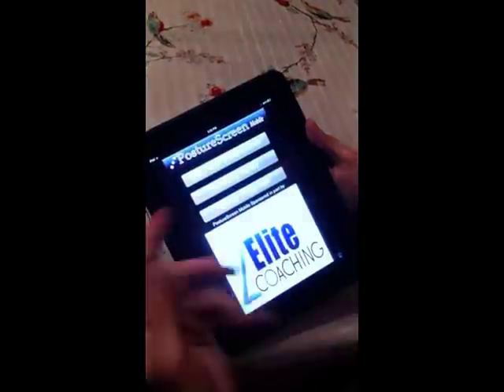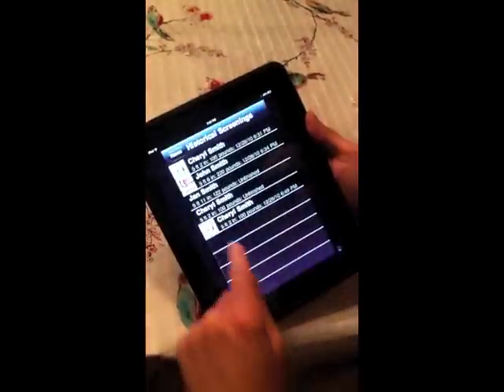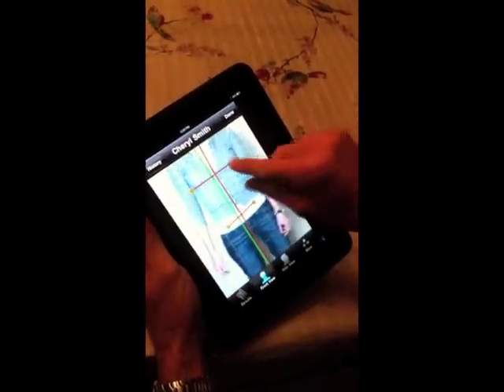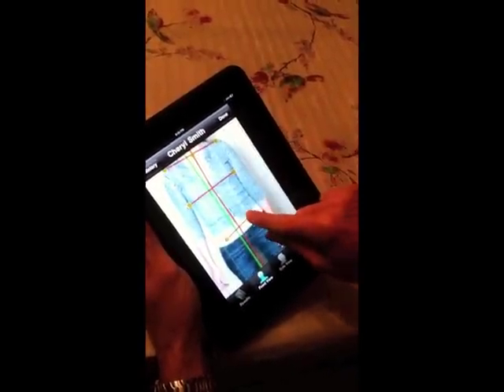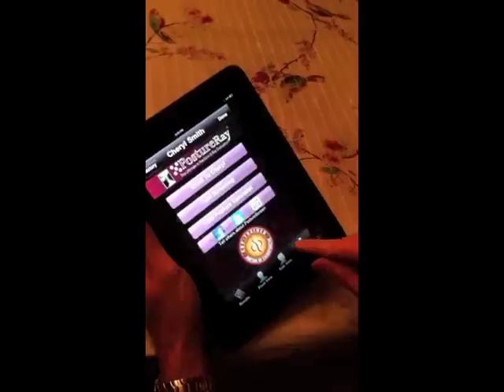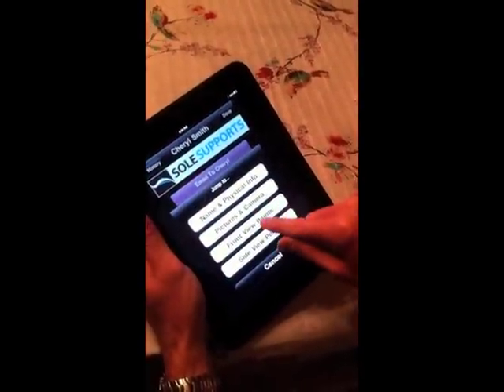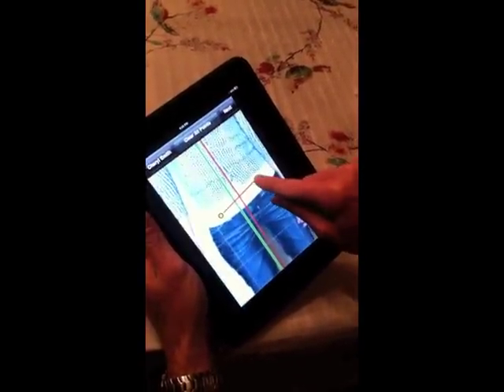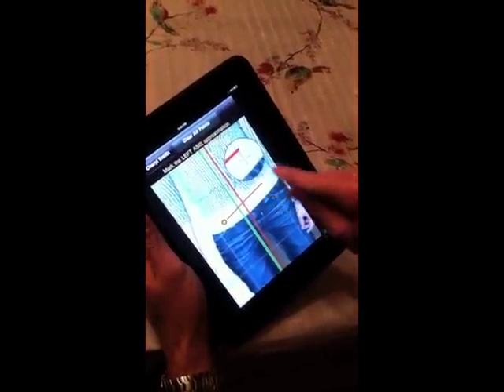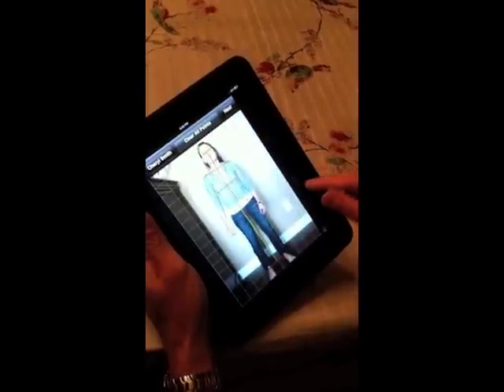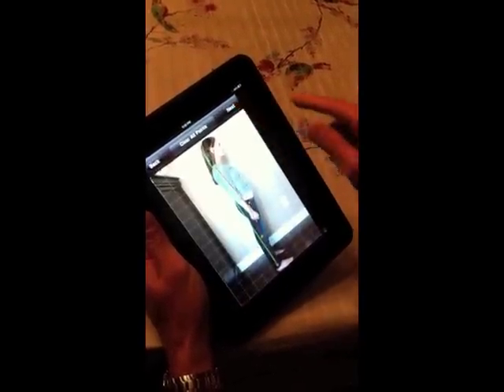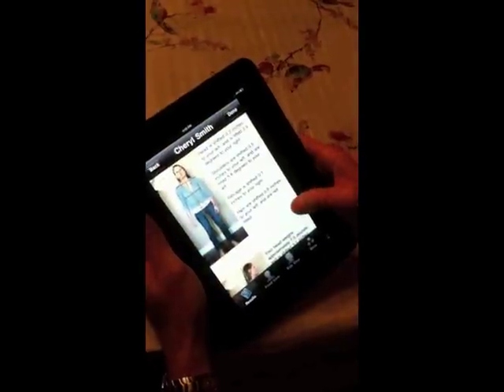If we want to go out of this and see our screening history, we can come back in here. If we wanted to edit any of those points, we can go back in, zoom in, hit 'edit screening,' select 'front view points,' zoom in, and drag the point to the correct position. It then recalculates everything for you.